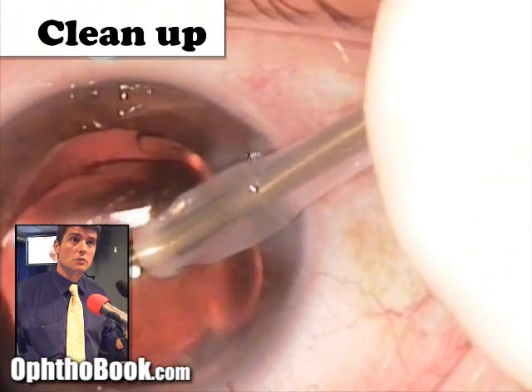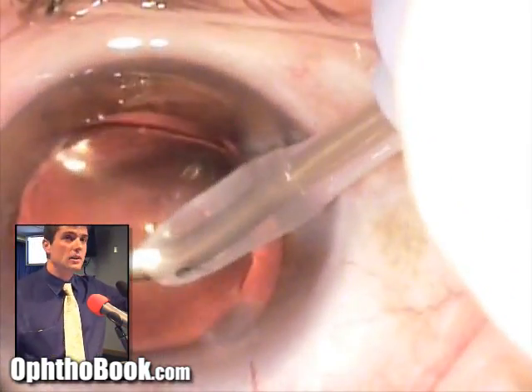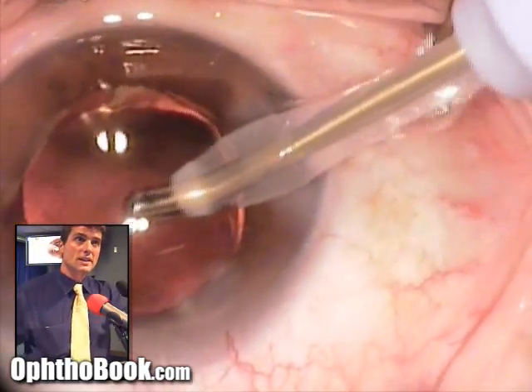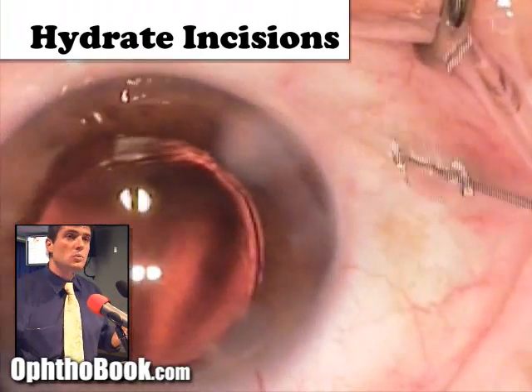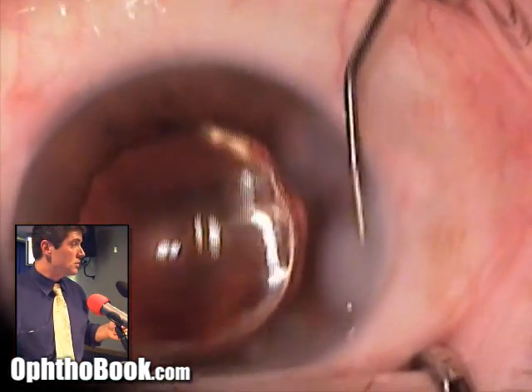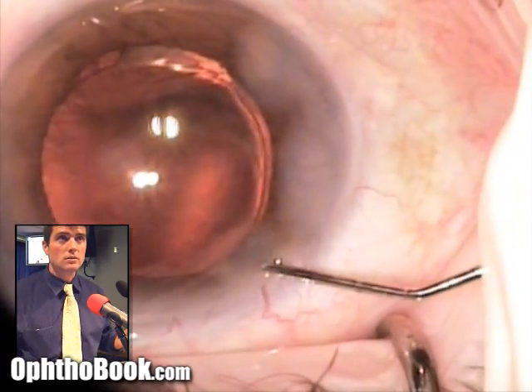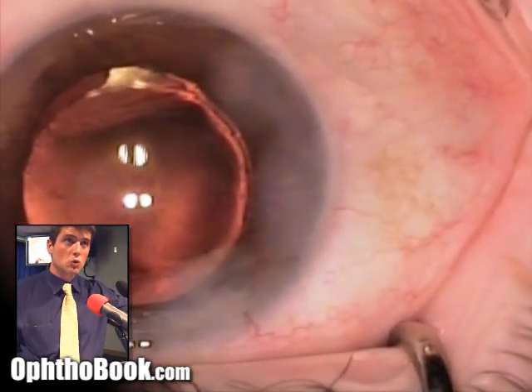We're almost done — we still need to remove the viscoelastic gel from the eye. You can see the lens spinning around because viscoelastic behind it rushes forward as we aspirate it out. Then we hydrate our incisions with BSS solution so they don't leak — the main keratome incision first, then the paracentesis as well. Finally, we check the pressure with a Q-tip to confirm it's about normal and that the wounds are sealed and not leaking. And that is how we do a cataract surgery.